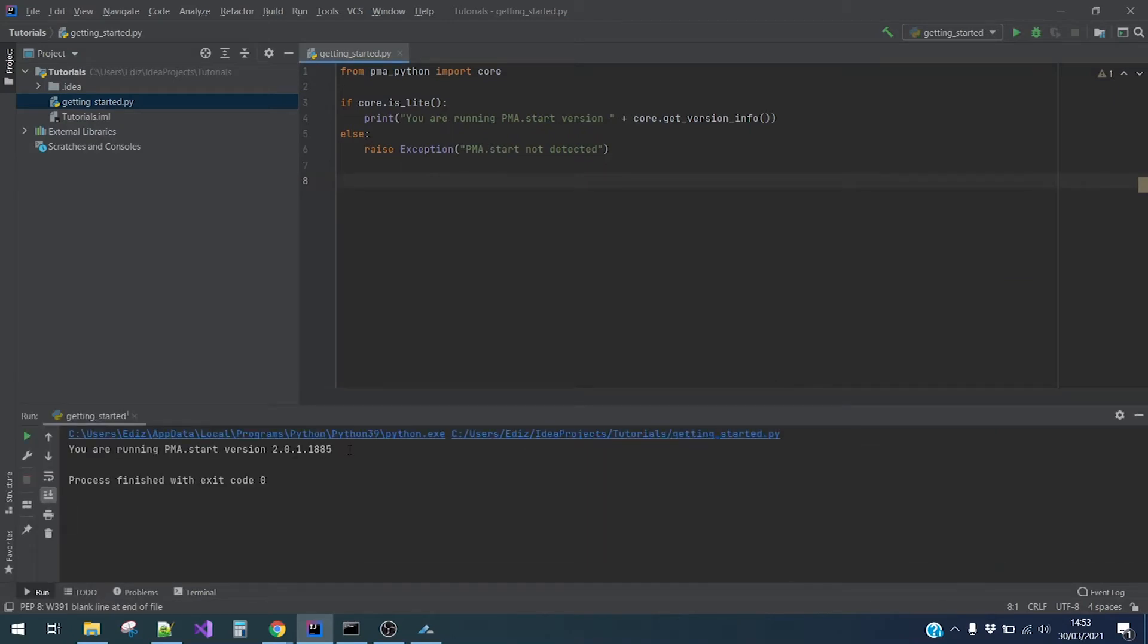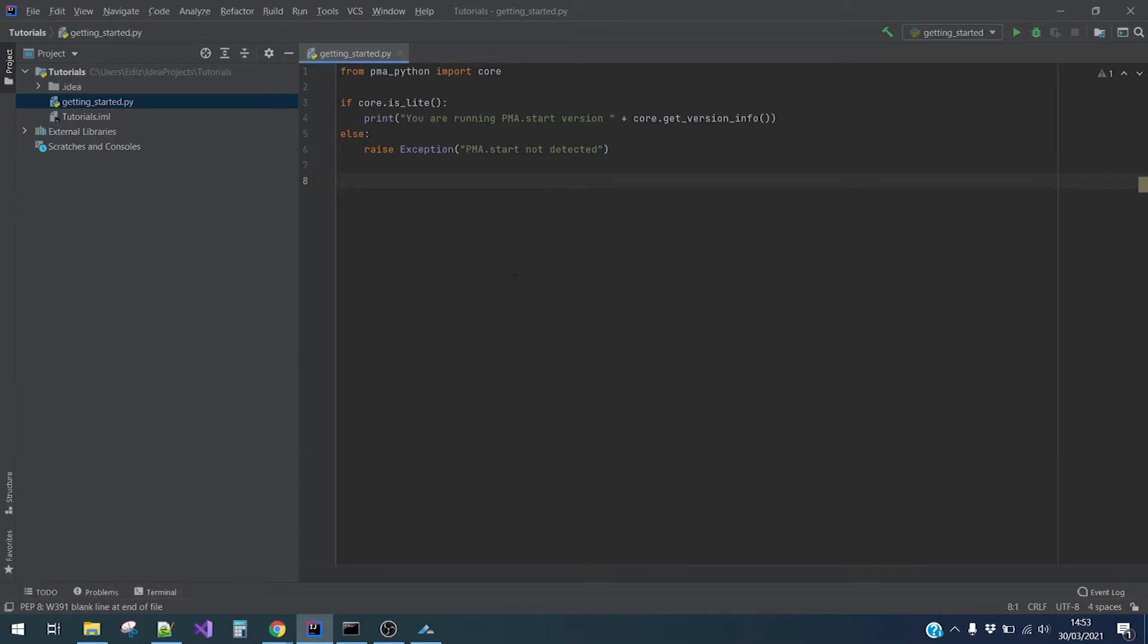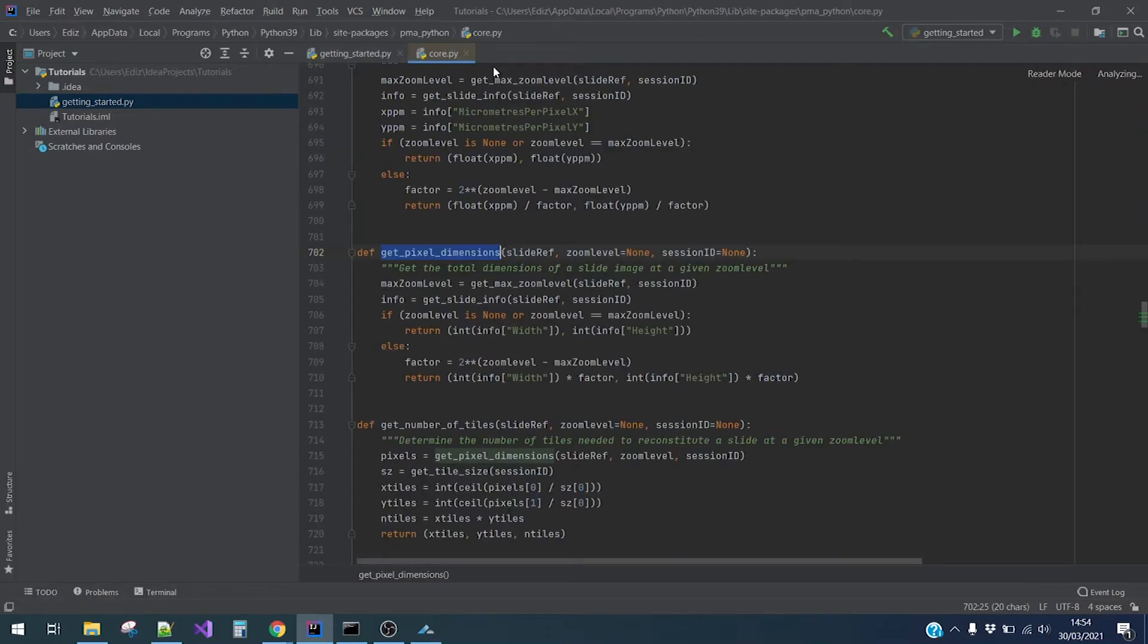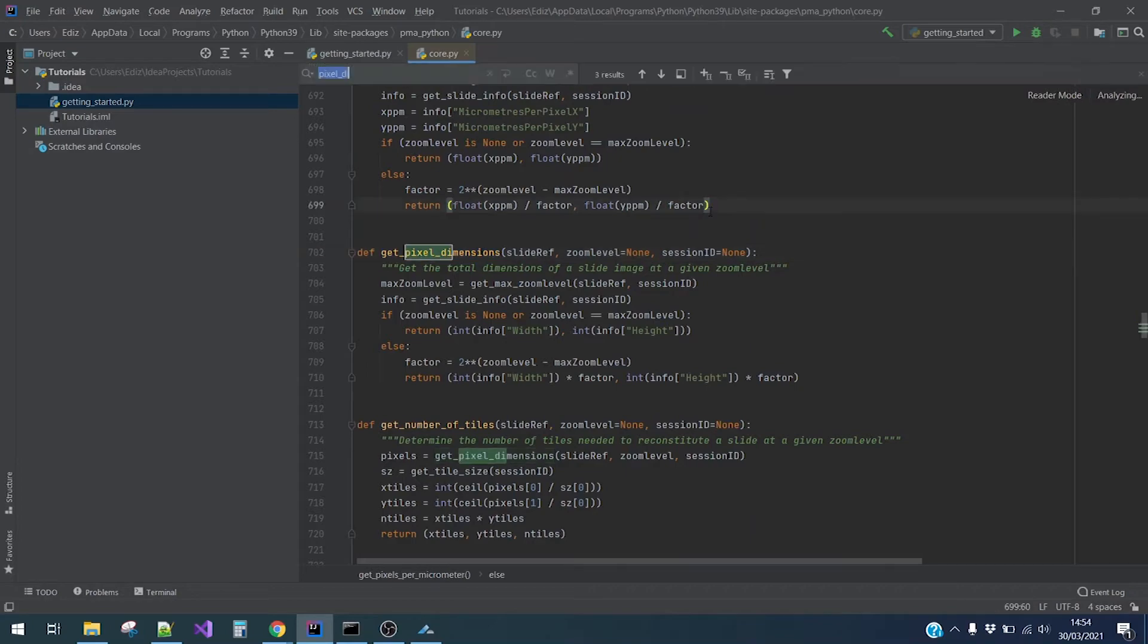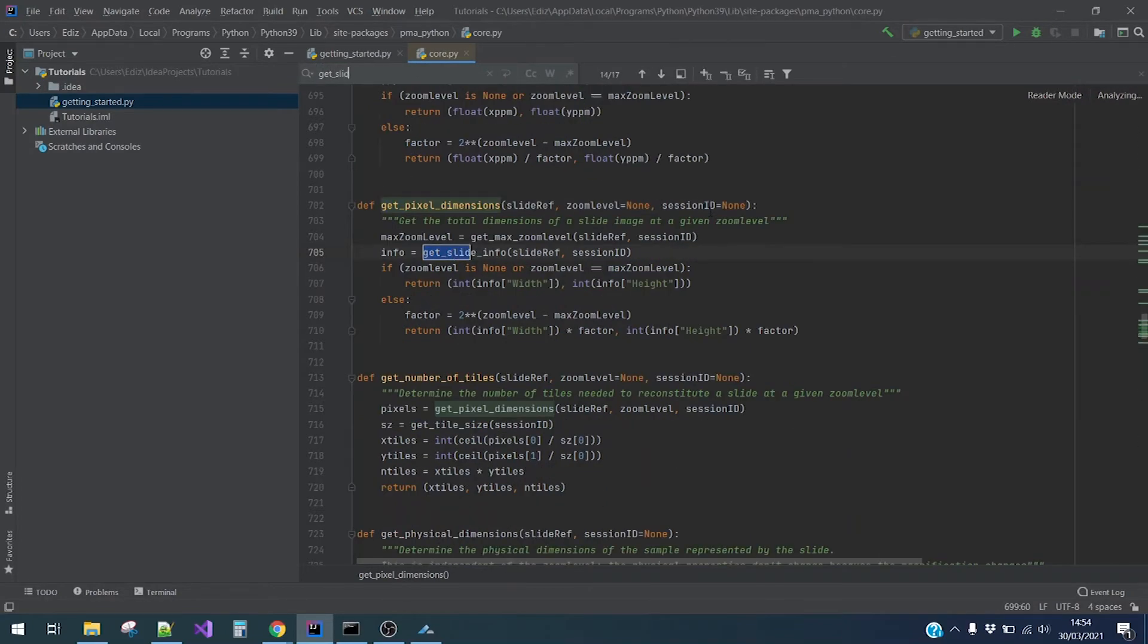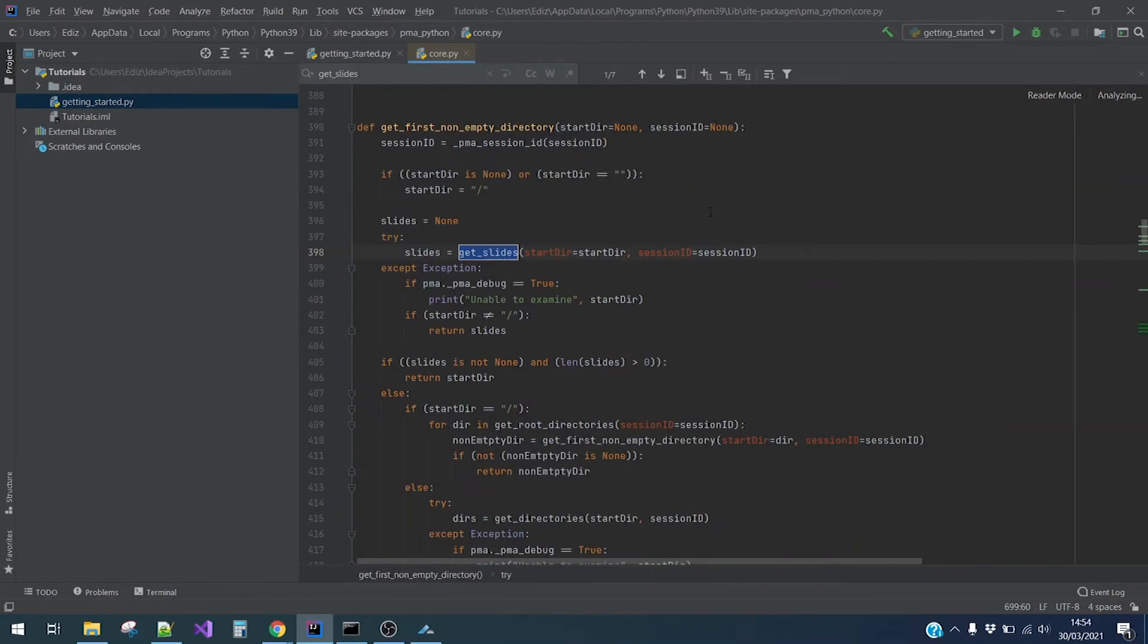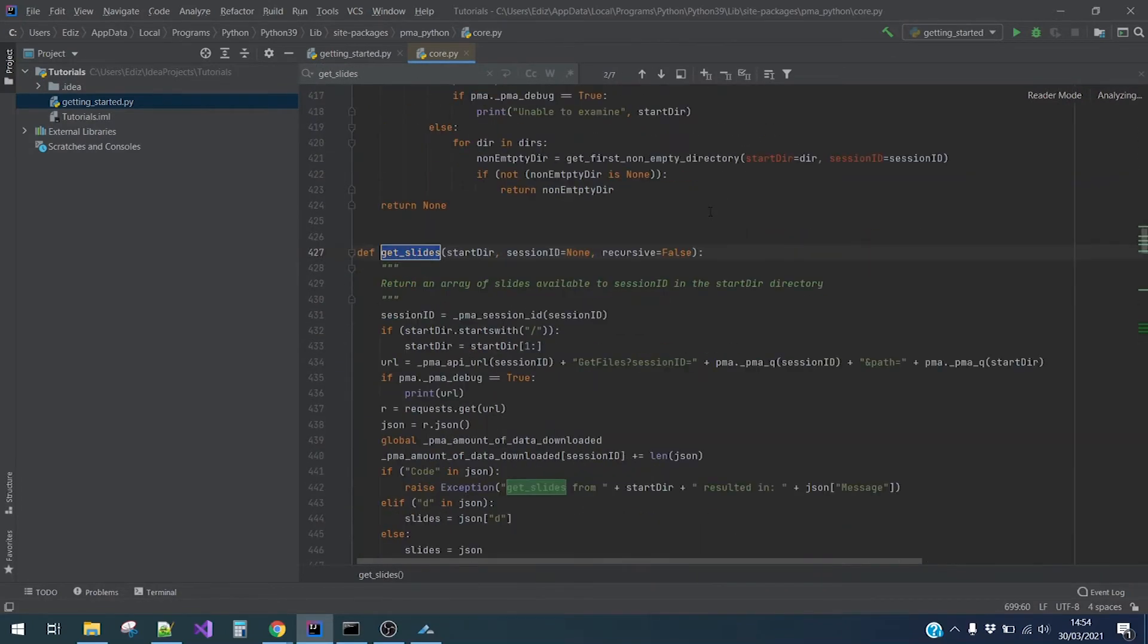Next, let's navigate through the core.py source code. In IntelliJ, the IDE I'm currently using, you can do this by CTRL plus clicking on core.py. So in the source code, you'll find all the different methods together with an explanation of what they do.